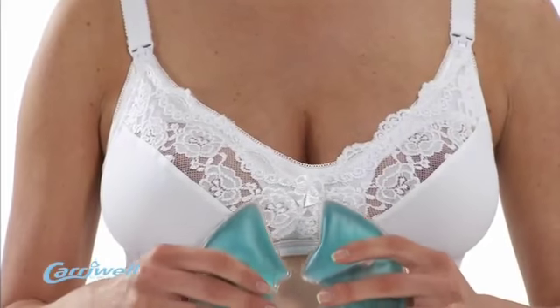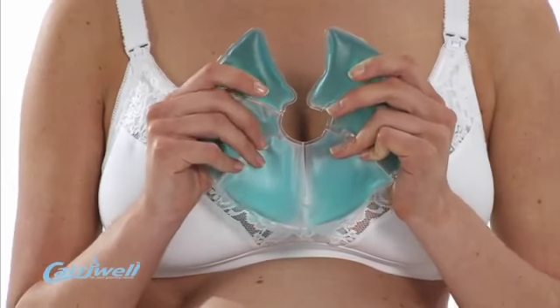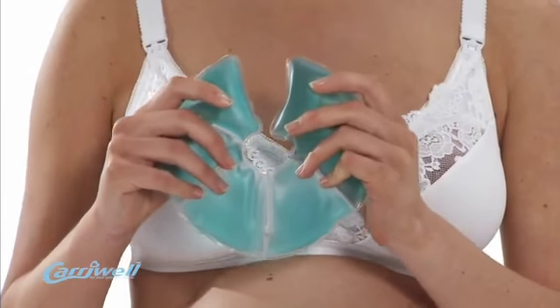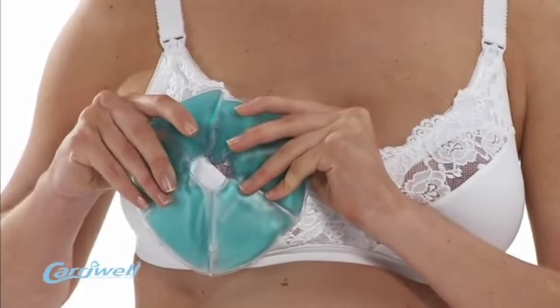The Carriwell Breastsoother has been specifically designed to soothe the sore breasts of women who are breastfeeding. The unique thermal properties mean it can be used in either a warm or cool therapy, depending on personal preference, and is soft and flexible, fitting comfortably over the breast.